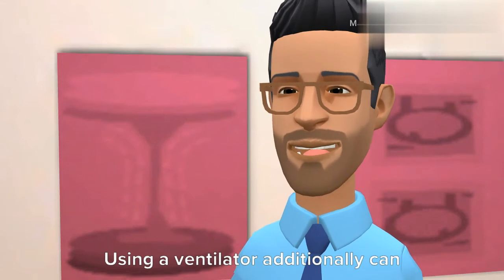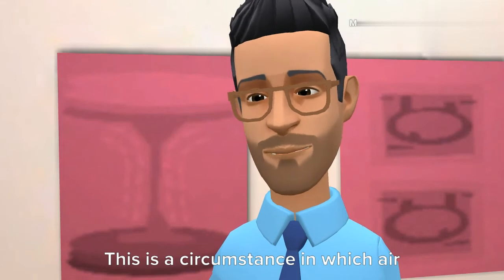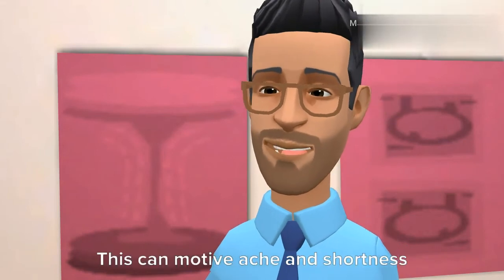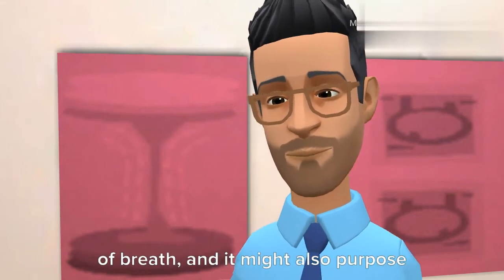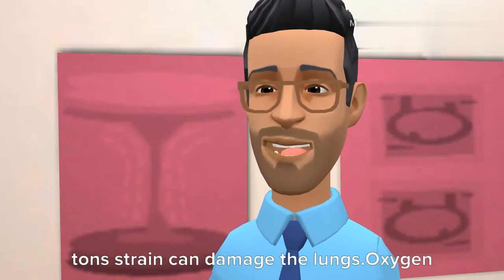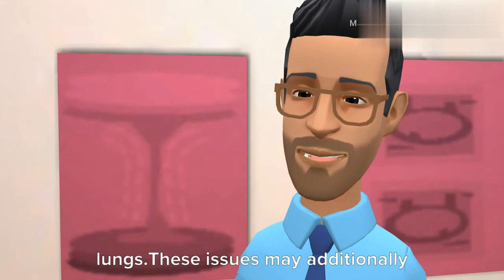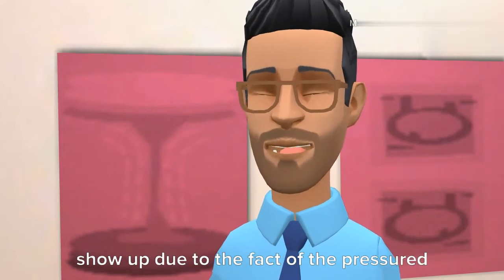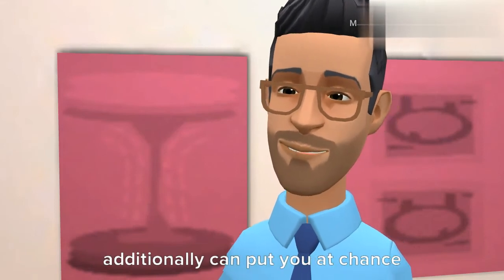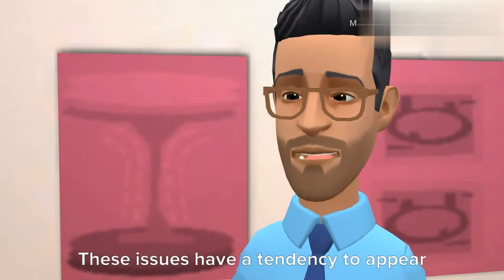Using a ventilator also can put you at risk for other problems, such as pneumothorax. This is a condition in which air leaks out of the lungs and into the space between the lungs and the chest wall. This can cause chest pain and shortness of breath, and it may also cause one or both lungs to collapse. Lung damage: pushing air into the lungs with too much pressure can damage the lungs. Oxygen toxicity: high levels of oxygen can injure the lungs. These problems may happen because of the forced airflow or high levels of oxygen from the ventilator.